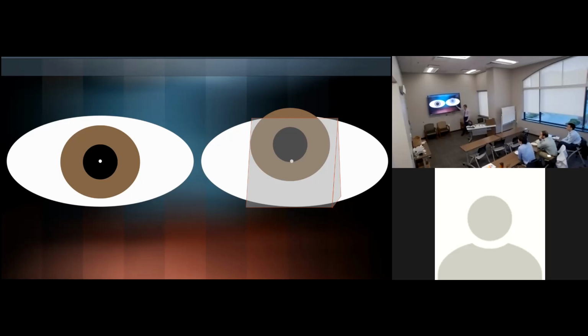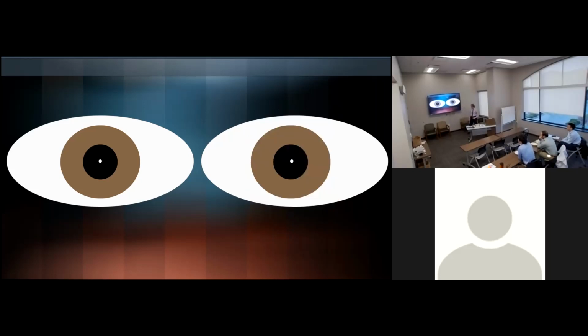So this is going to be CSM, this is going to be CSUM, and maintain. Okay. So this is an example. You put the prism, the light bent, but the eye did not recognize it. So no movement here, no movement there. So this is CSUM.